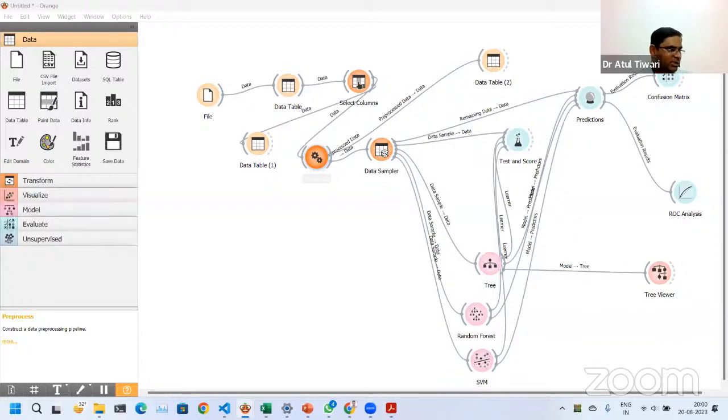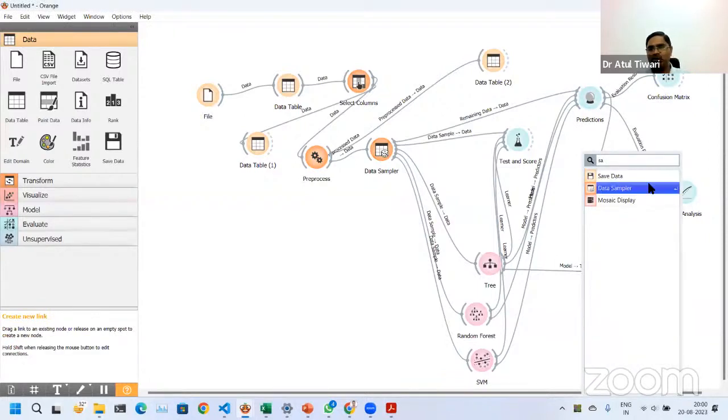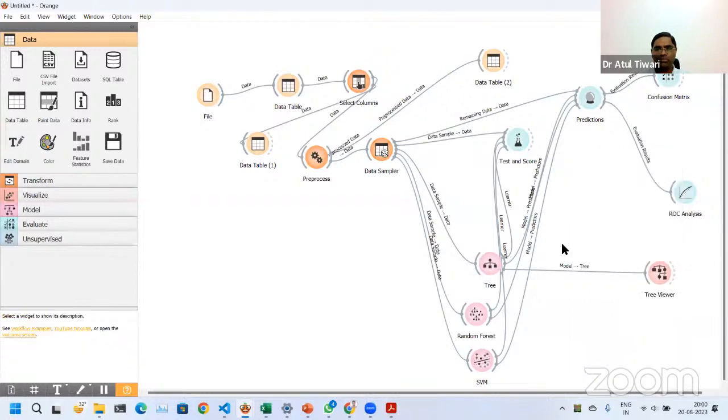One of the questions I'm taking from the bottom: how can we use this technology in our daily practice? Right now, out of the box, you can't use this particular model. If I click on save model, there is an option to export our data and create a model. But just by this, you cannot use it in real life as of today. You can incorporate it with your particular problem statement.